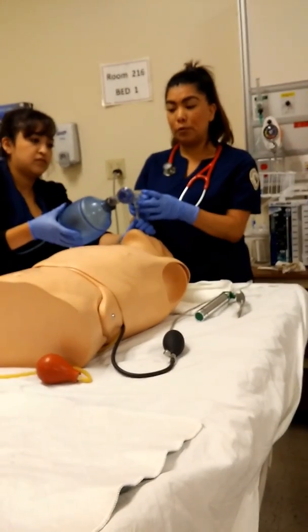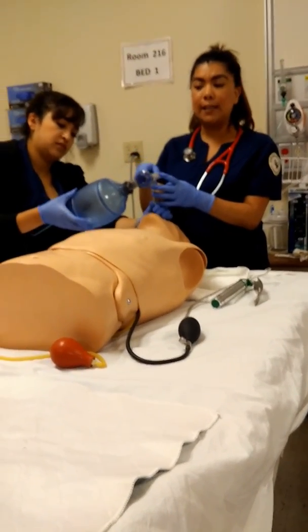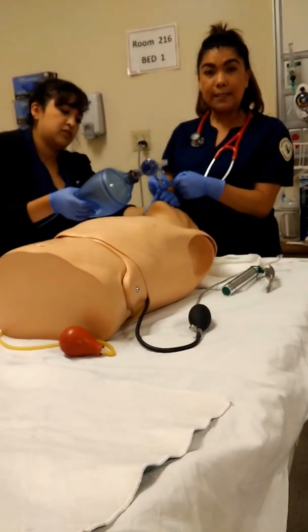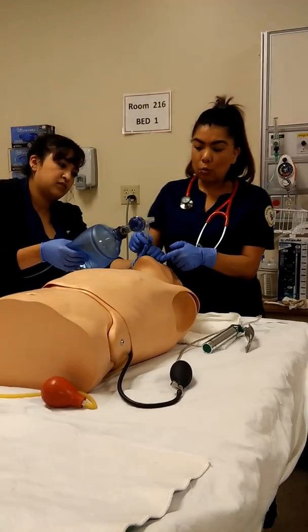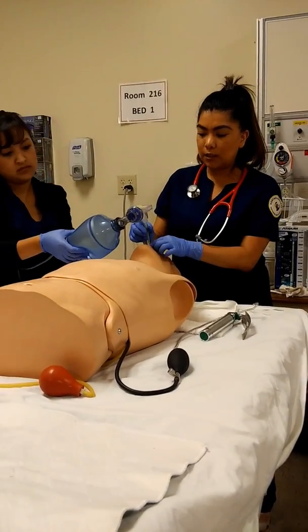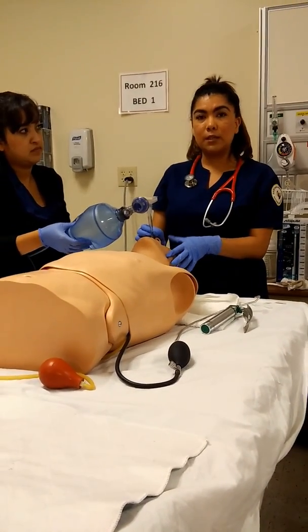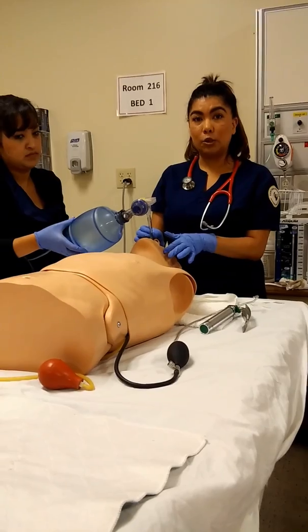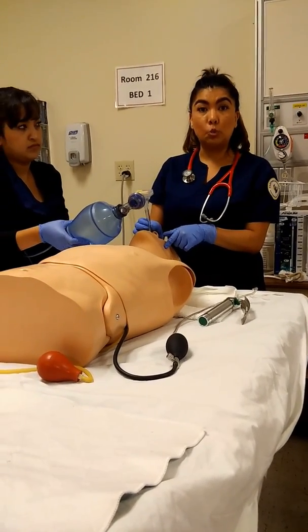It's going to turn from purple to gold, gold indicating that we are in the lungs. We're going to check for condensation on the tube as well. And when inserting the tube, for males it's going to be 21 to 23 at the teeth, and for females, it's going to be 19 to 21.